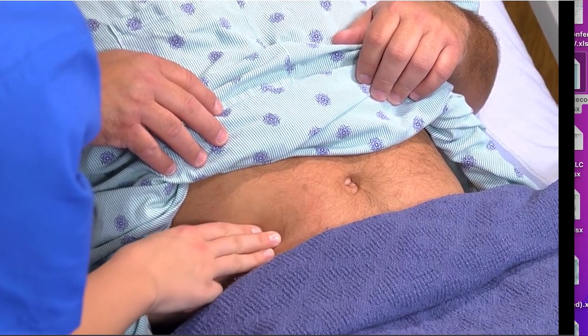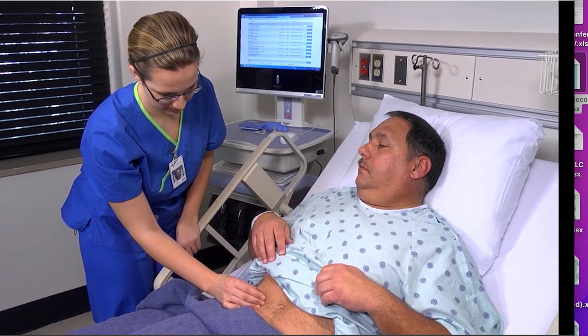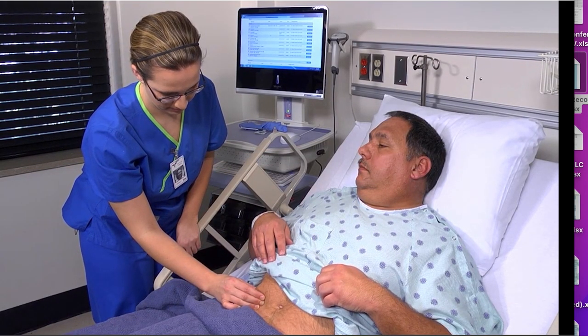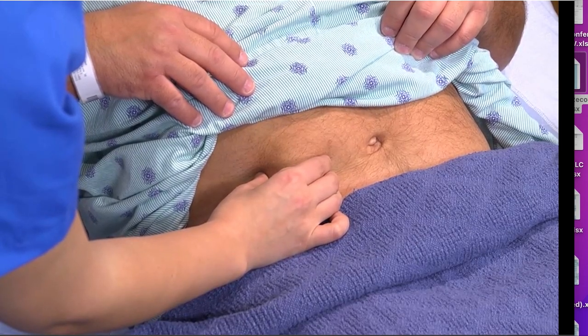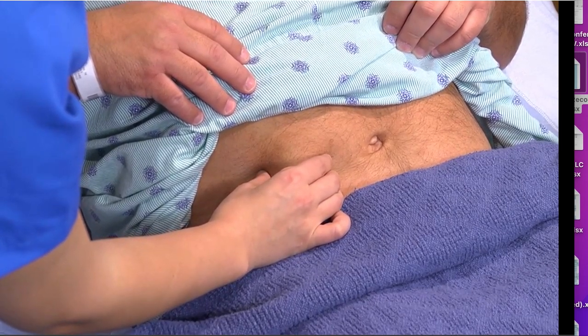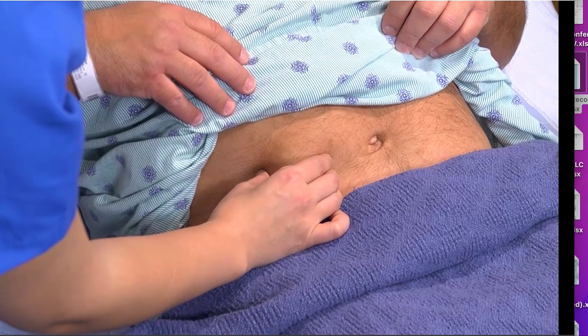To make sure you have the right size needle, use your thumb and forefinger to grasp a skin fold of tissue at the injection site. Measure the fold from top to bottom and check to ensure that the needle is about half as long.